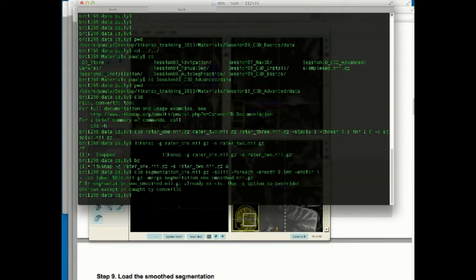So next we're going to use vote. As Phil was saying, we're going to use a wildcard. At this point we will have all those 10 labels that we split and wrote out into the stack.